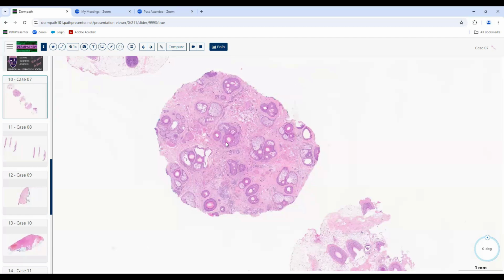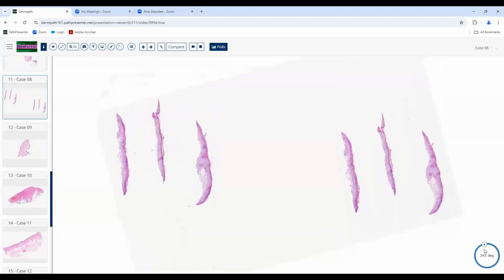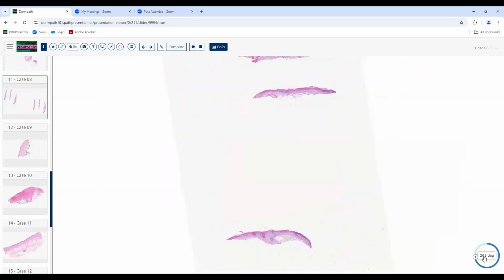So there's a nice way to work through alopecias. And if it's systematic and you go through that, just like with panniculitis, you can usually make a correct diagnosis. From your standpoint of the board examination, they're going to give you things that are pretty straightforward and not things that are going to be esoteric and almost impossible to diagnose.